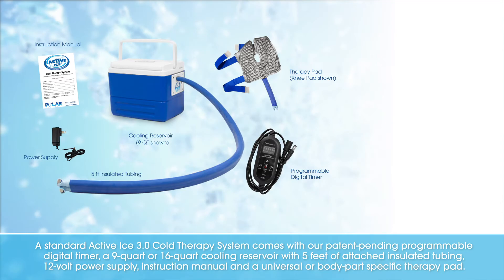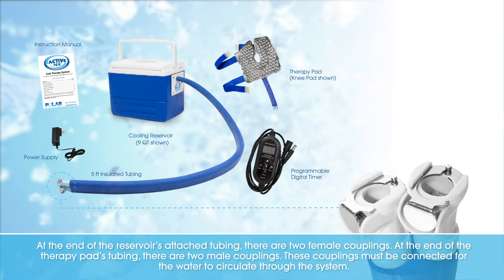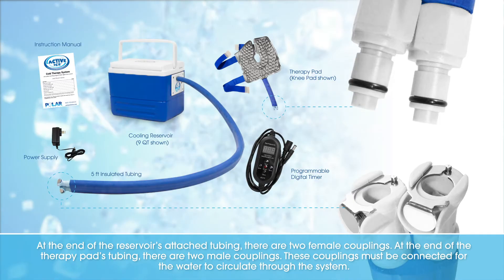At the end of the reservoir's attached tubing, there are two female couplings. At the end of the therapy pad's tubing, there are two male couplings.